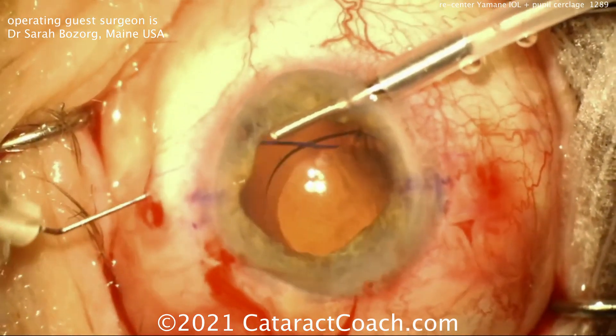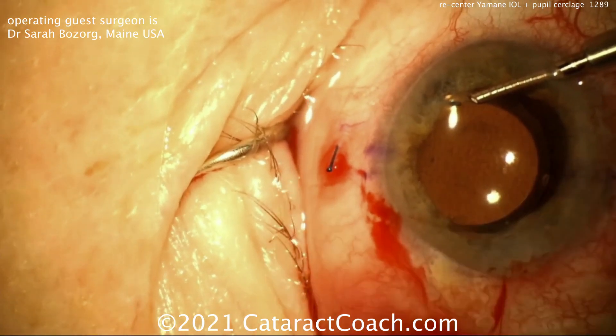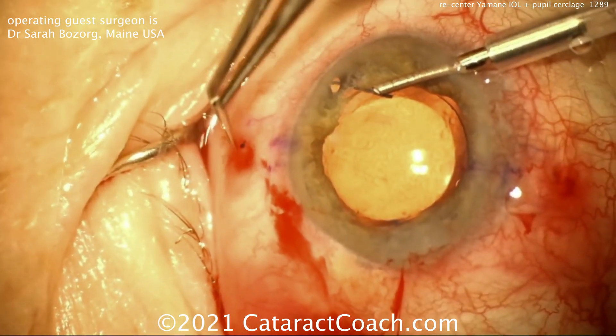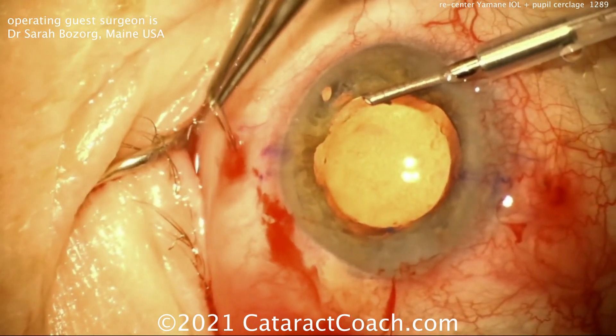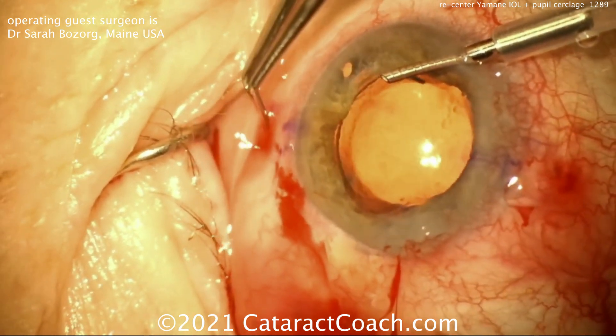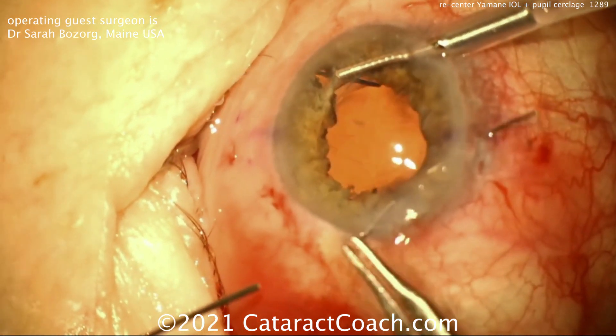Now with the new entry site, she'll externalize the haptic, do a little flange cautery there at the tip, push that in, and now the IOL is much better centered. Very nice technique. Then push that right into the tunnel — don't let that nub and flange stick out too much.